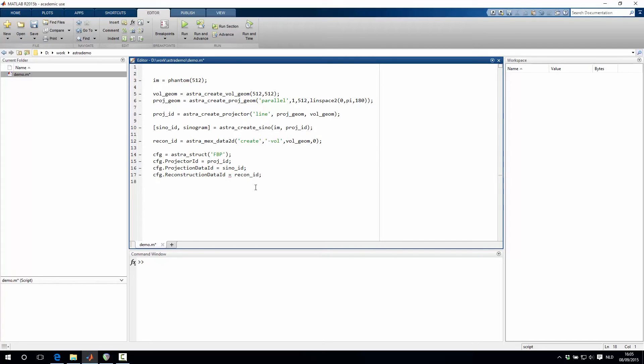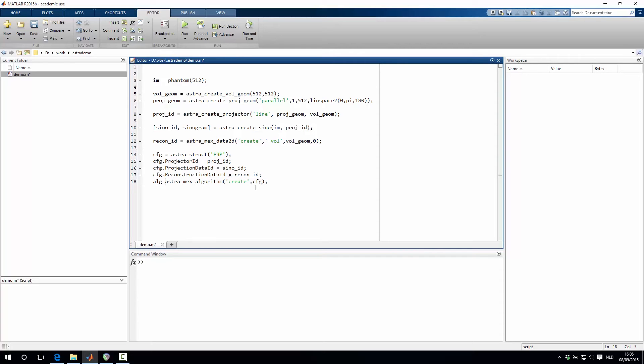That should be all, so then we can type astra_mex_algorithm, create an algorithm based on this configuration structure. And this then returns an identifier to an algorithm object.